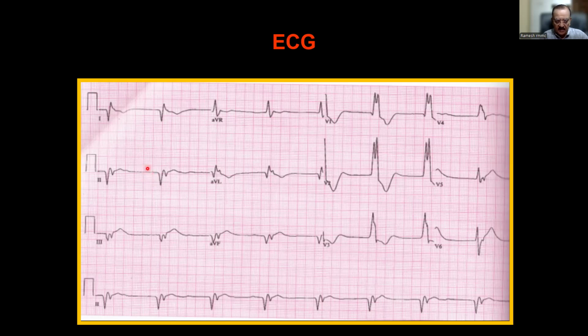So what does it mean? The sinus node has not fired an impulse. It has not produced an atrial depolarization. The primary pacemaker has failed. Then how does the fellow live? That's because of the secondary pacemakers taking over. The ventricle is taking over. This is one ventricular beat. This is another ventricular beat. The ventricle waits for the next sinus beat to come. The next sinus beat is not coming, so a ventricular beat. Then again it waits for the next P wave, not coming, so a ventricular beat. So this is entirely a secondary pacemaker rhythm.